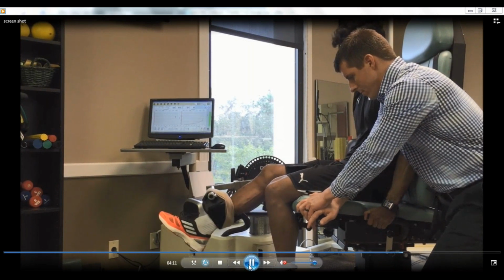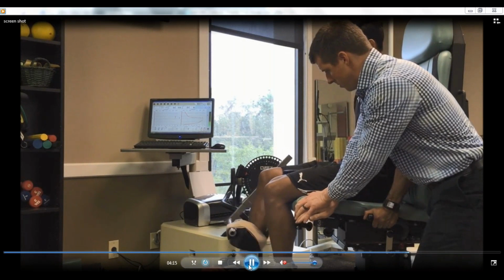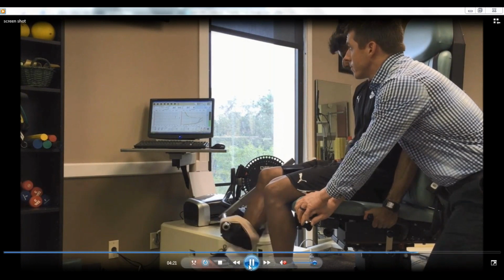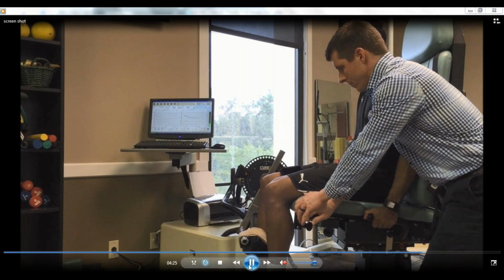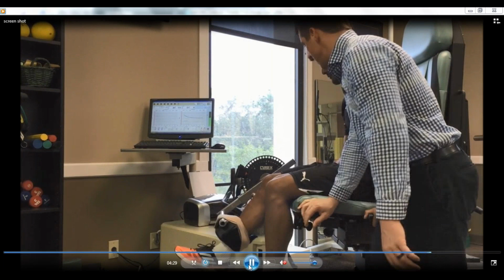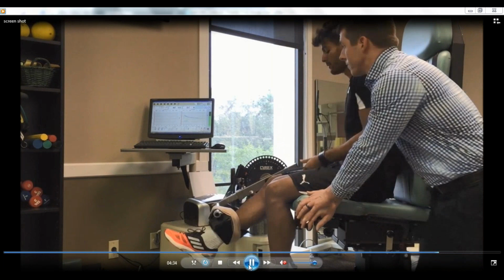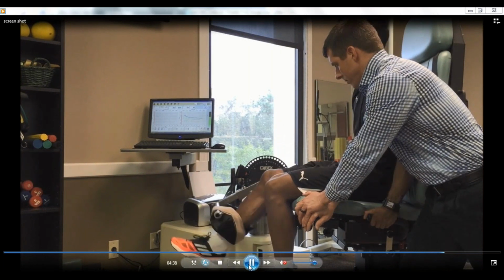Now I'm holding down the chair because our patient here is strong, and so the chair is actually going to lift up. And you can even see that at this time we needed a new thigh strap. Now, we even reinforced the strap at the bottom because he's so strong that he would pull through it. Normally I would stand in front of the patient with one hand on the chair and the other on top of the thigh strap and thigh, but I'm standing off to the side just so you can see for the video. Normally we wouldn't have that issue, but I wanted you to see the athlete here.